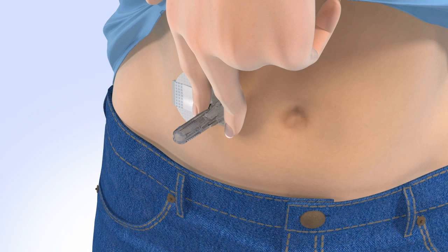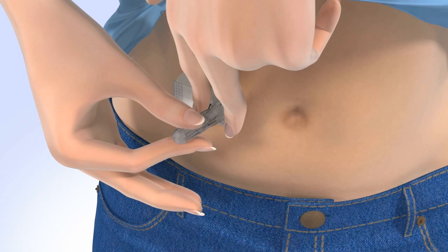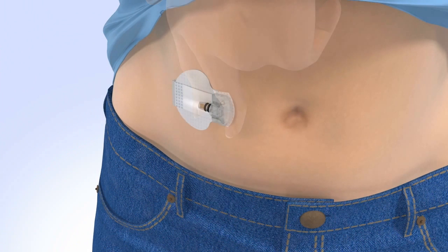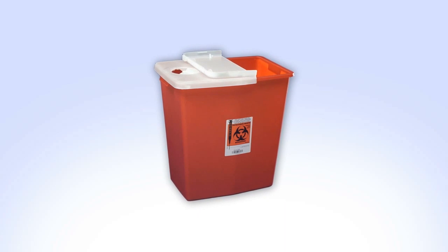Be sure you do not hold or pinch the sides of the sensor. With the other hand, hold the needle housing at the tip and slowly pull straight out away from the sensor. The needle automatically retracts inside the plastic needle housing. Discard the entire piece into a sharps container.